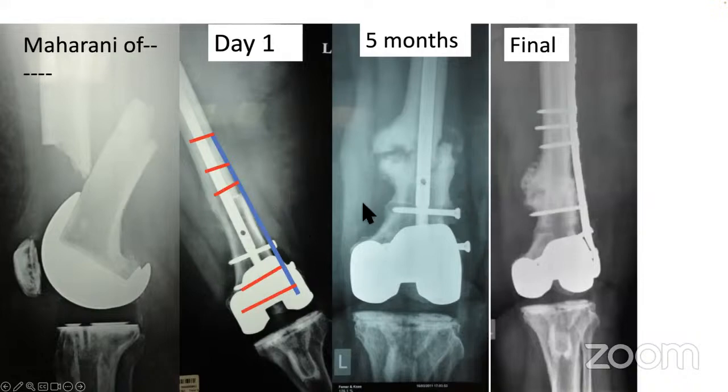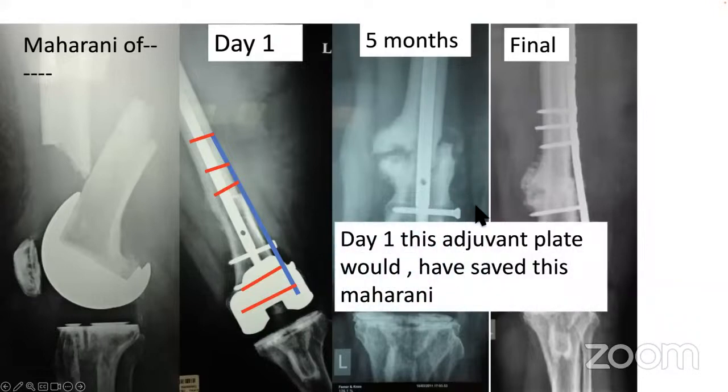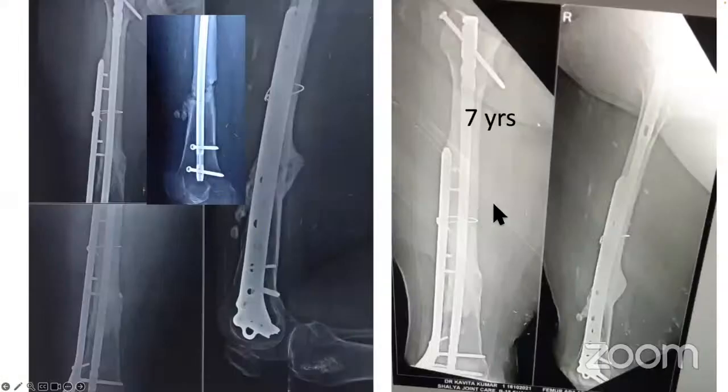Today, it has been accepted by everybody that for this junctional fracture of the upper 2/3 and lower 1/3, where the medullary cavity is expanding, on day one you should put in a nail and a plate to be 100% sure. On day one, this adjuvant plate would have saved this. Now, all this, you can see the fracture. Again, you do the adjuvant plate and it heals up. So why not on day one? This sort of fracture, do not accept.